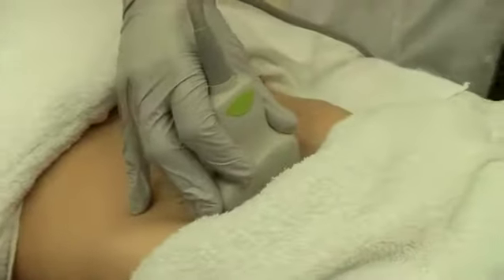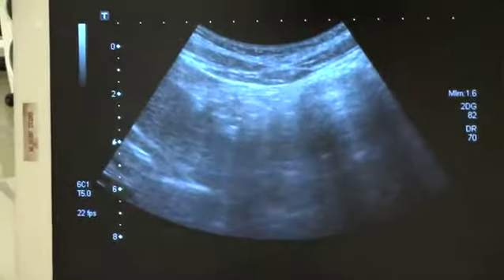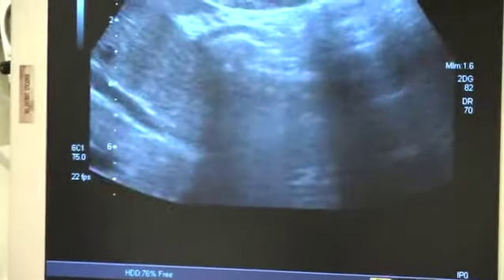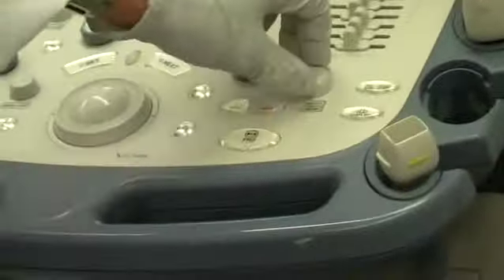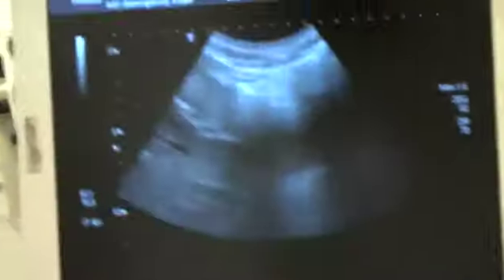I'm starting in the subxiphoid, right just below the xiphoid process. I can see my depth is set at about 8 centimeters. I probably need a little more depth than that. There are a couple of patients that we get here at UC Irvine from time to time that have indulged at a place called McDonald's. These patients occasionally are, how do we say, rotund. These rotund patients are a little challenging to image at only about 8 centimeters or so.